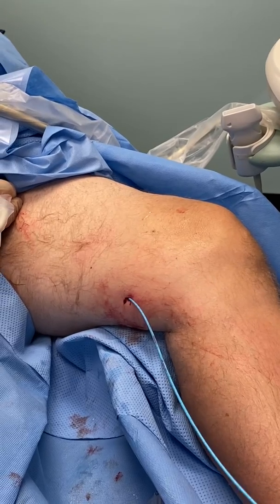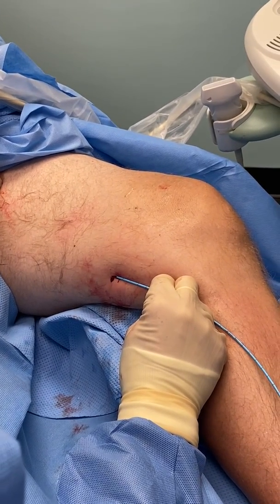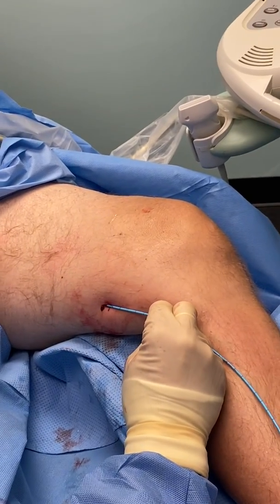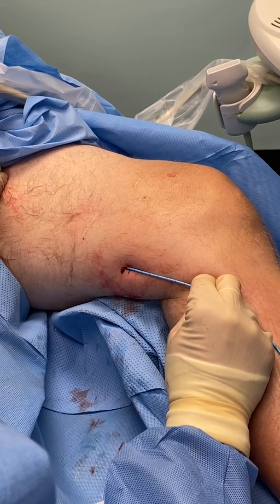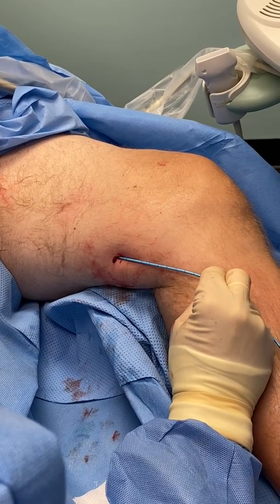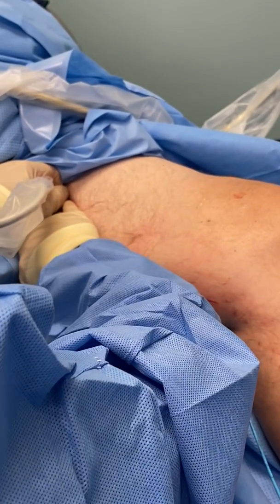We're going to inject the first aliquot. [Counting: one one thousand, two one thousand, three one thousand.] One, two, three — inject. [Counting: one one thousand, two one thousand, three one thousand.] One, two, three. Now I'm going to compress for three minutes at the junction.